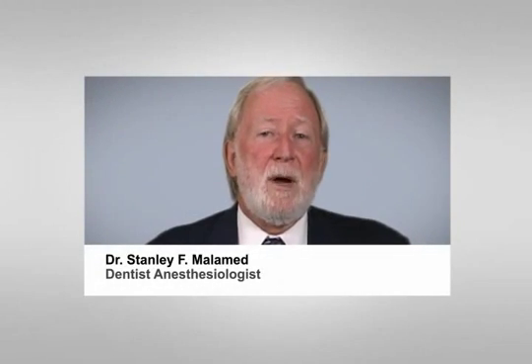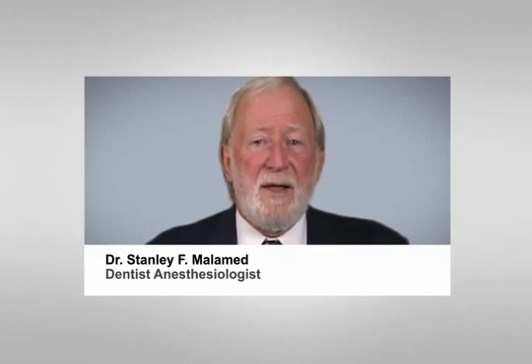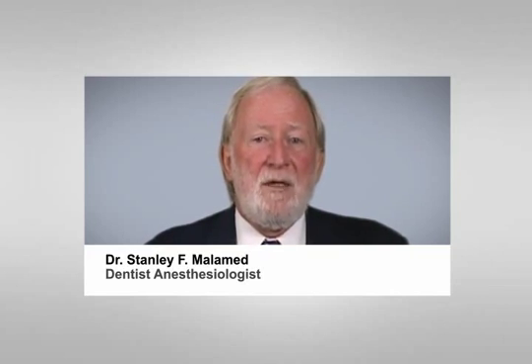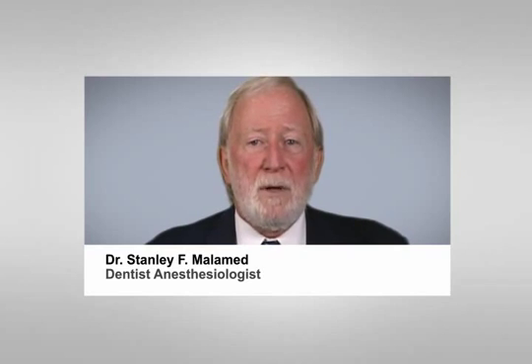The STA system allows you to use the birotational insertion technique to prevent needle deflection, minimizing missed blocks, making your blocks more accurate, and providing a shorter onset of anesthesia. Additionally, the STA is the only injection system available that allows one to employ a unique multi-cartridge injection. Let's discuss how to begin.